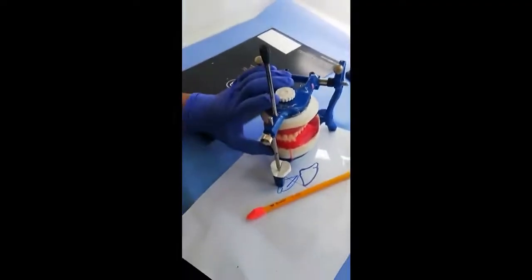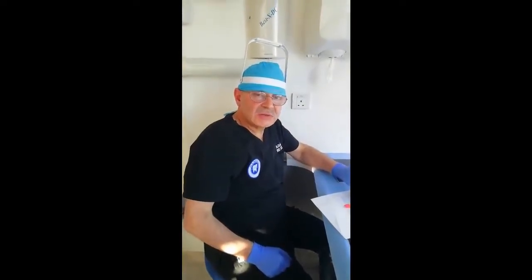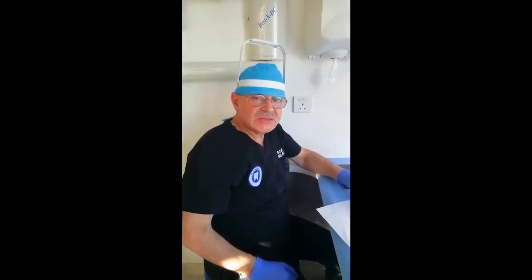Now, the coming video will be the sitting of the posterior lower or the mandibular posterior teeth in balanced occlusion.